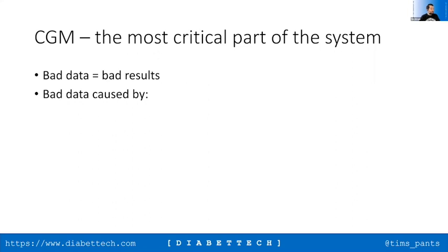And what's bad data caused by? So there are lots of reasons why we might get bad data. People want to shout them out or put them into the chat system. A hot day. That's one of the more unusual ones I've found, but okay. Dehydration. Having a shower. Having a hot shower, I should say. Light. Sorry, light, did somebody say? No, lying on it. Oh, lying on it. Light is true if you're using Eversense, but yes. Cold water. First few days of use where it's settling down. A duff sensor. Yeah, that's a big problem.